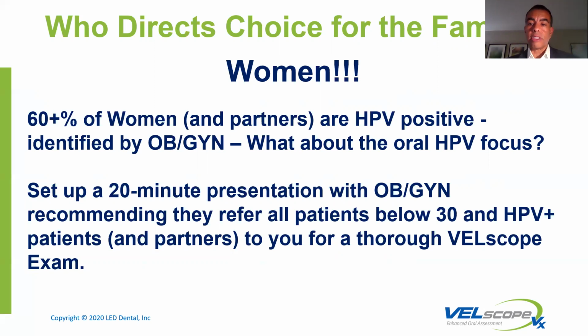not only between obviously oral cancer and HPV, which they know, they just don't know how prevalent it is, but then from that, how we can transfer that patient to the dental practice and obviously make sure that, yes, they're getting screened for cervical cancer here, but we want to make sure they're getting screened for oral cancer here. And this is how we do it. And we have a technology that's beneficial and effective and safe. And again, inexpensive. You tell an OBGYN that we have a test that's only $25, they're like, why isn't everybody doing this? So again, something that we can provide.